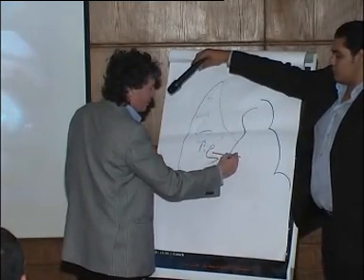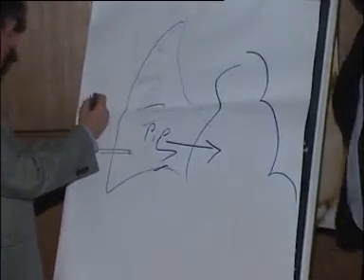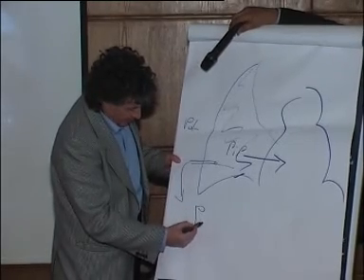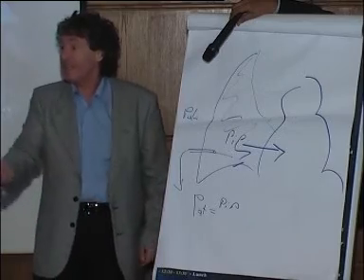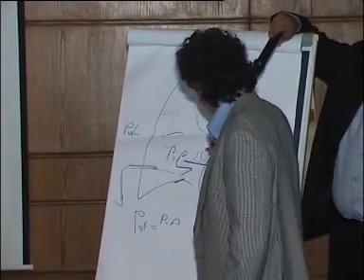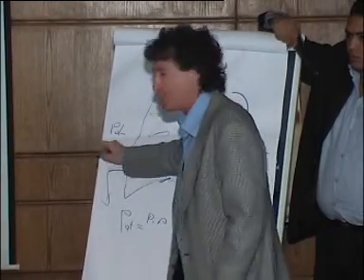Pressure is positive, and of course if you put a needle here, from atmospheric pressure, for sure the fluid is going out like this, and you don't have to aspirate. Spontaneously the fluid is going to leave the cavity until the balance between atmospheric pressure and intrapleural pressure. It's the same for compressive pneumothorax. You have a shift of the mediastinum, which means a very high intrapleural pressure. The first sign is patient asphyxiation. You put the needle like this and you deflate.